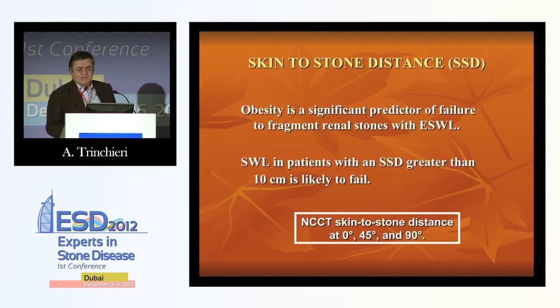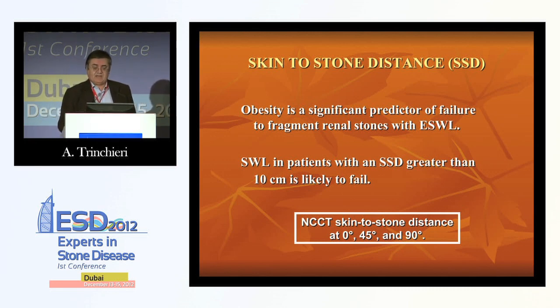Another point that should be pointed out is that it's important to have information about the skin to stone distance, because obesity is a significant predictor of success of shockwave lithotripsy, and it is demonstrated that when the distance between the skin and the stone is more than 10 centimeters, the possibility of success is reduced.